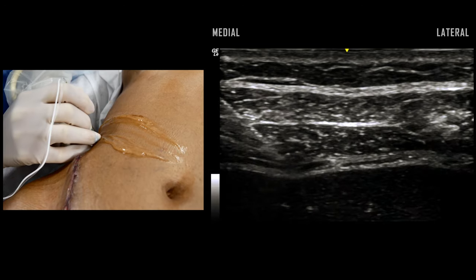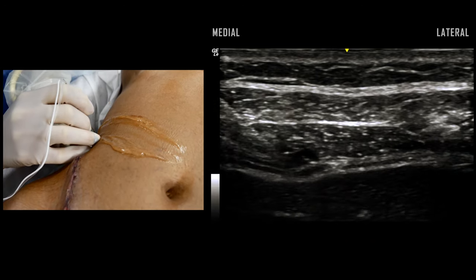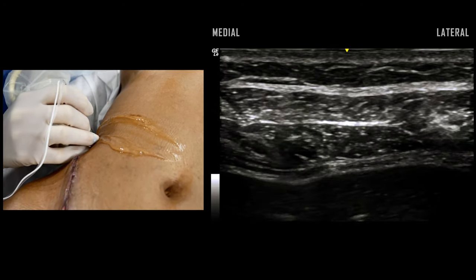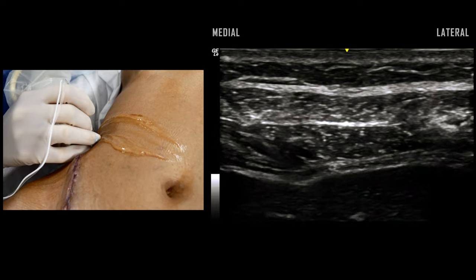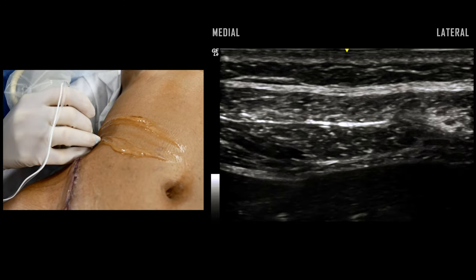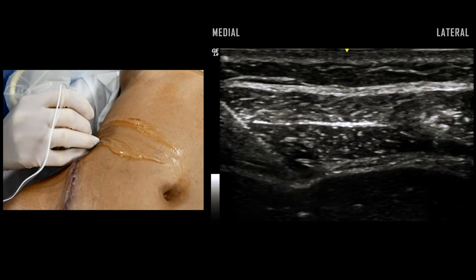Hydrodissection with normal saline does not show clear separation of the two layers, suggesting that the needle tip is likely intramuscular. Further advancement is necessary.